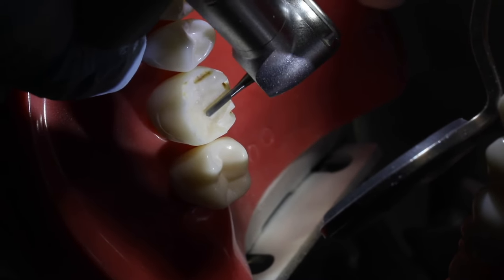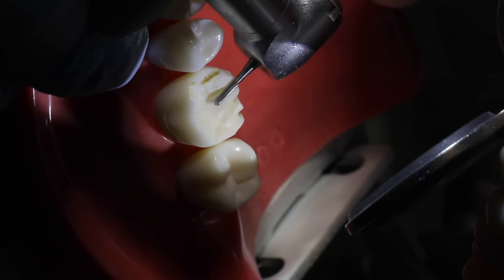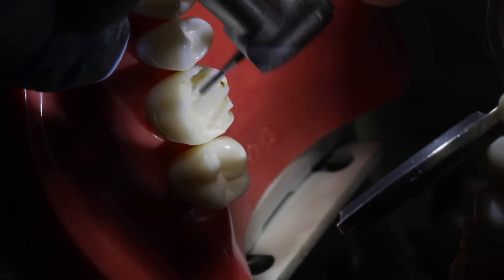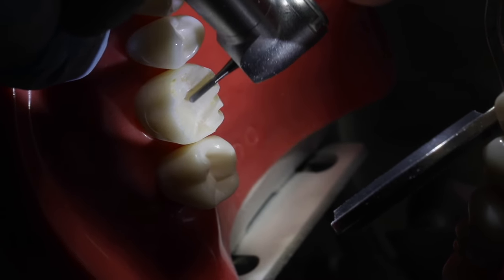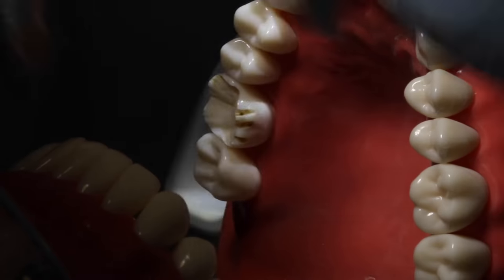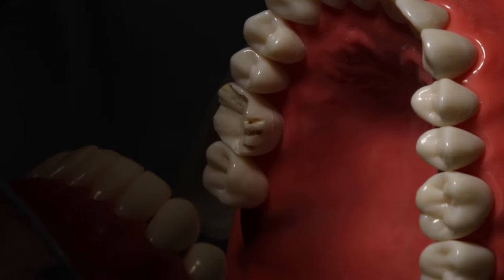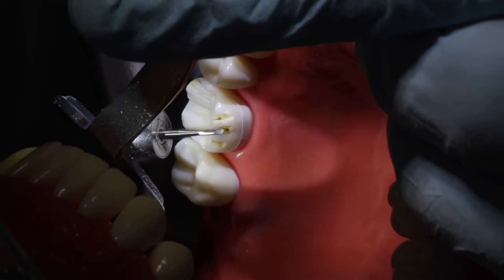Remember, this mesiolingual cusp has a very large flat surface that faces to the buccal. So we're basically just connecting that. Now we'll do our functional cusp bevel, and we want to pay particular attention to maintain the direction of that lingual cusp, that it goes from distal to mesial.